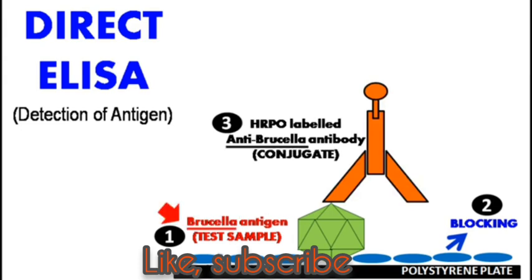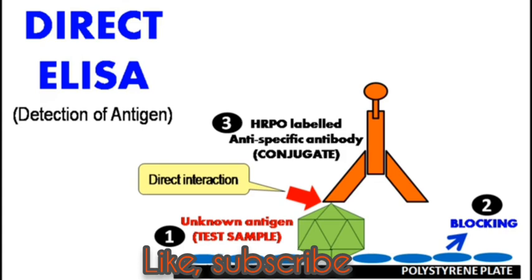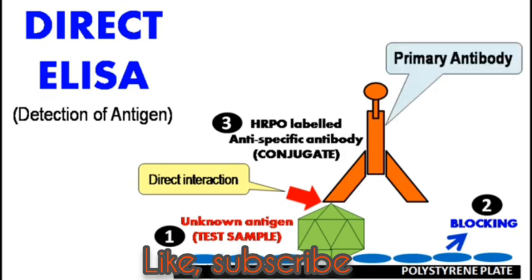For example, if the Brucella antigen is to be identified, then known HRPO-labeled anti-Brucella antibodies are used. If the rabies antigen is to be identified, then known HRPO-labeled anti-rabies antibodies are used. That is, antibodies used for detection are specific to the particular antigen. Since these antibodies are in direct contact, or direct interaction, with the antigen, they are considered as primary antibody.